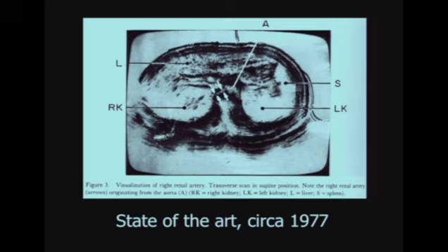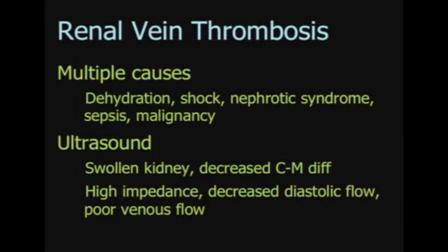And it's rather remarkable where we've come. Here's not so very long ago. This was the best we could do with evaluating the renal artery. Today we're able to get beautiful images and actually make some meaningful diagnoses for our clinical colleagues.